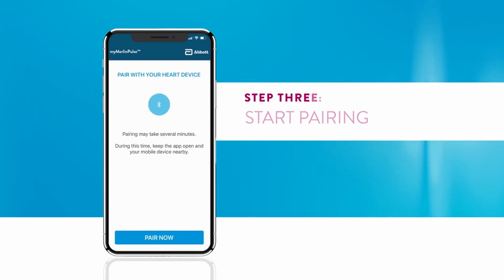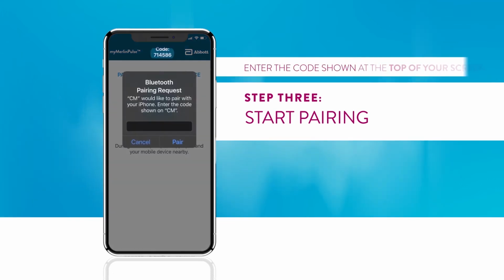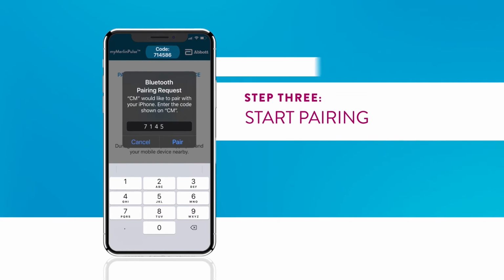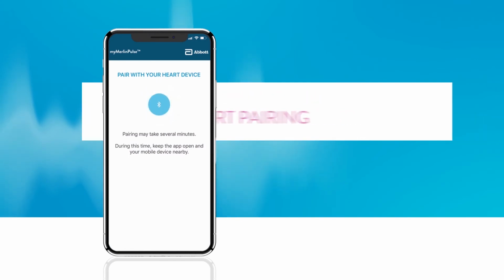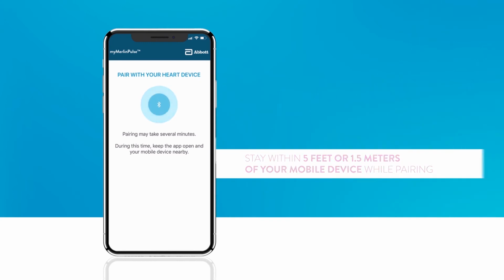Step 3. To pair your device with your app, click Pair Now. A Bluetooth pairing request with a CM message will appear. Enter the code shown at the top of your screen and click Pair. Pairing may take several minutes. During this time, keep the app open and nearby you. It needs to stay within 5 feet or 1.5 meters of you throughout the pairing process.